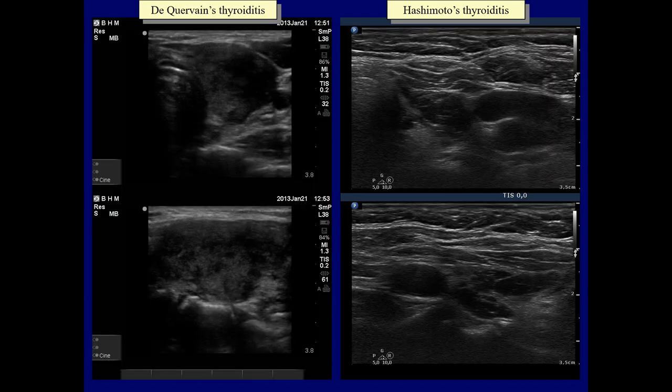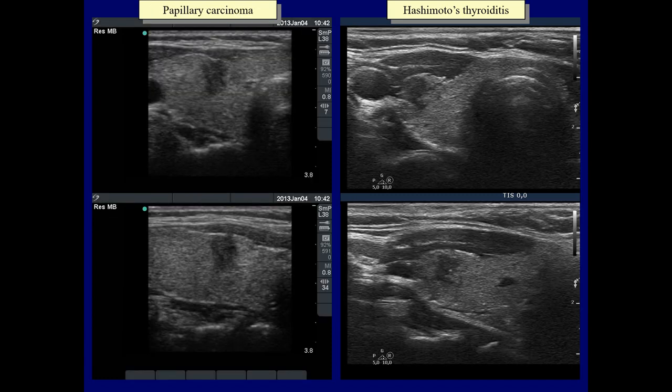Both cases present multiple hypoechoic areas. The borders of these lesions are blurred in de Quervain's thyroiditis while sharp in Hashimoto's thyroiditis. There is no significant difference between these cases; moreover, the benign lesion presents microcalcification, therefore it is more suspicious. Note the taller-than-wide sign in the irregular shape of the nodules. Paradoxically, the benign lesion presents microcalcification.